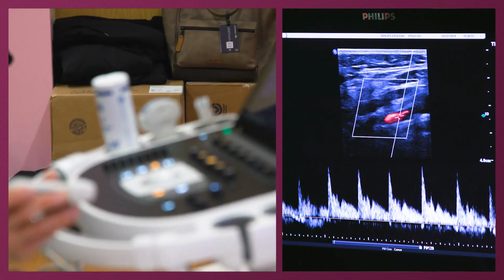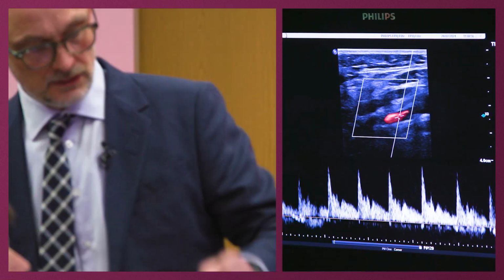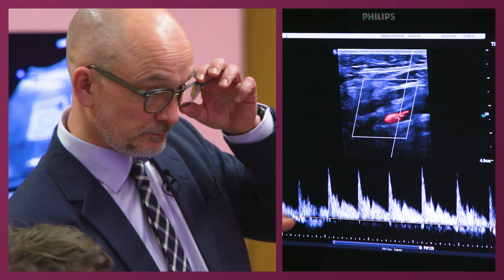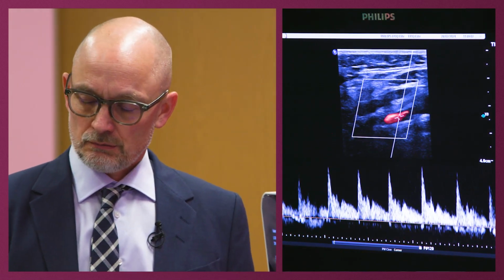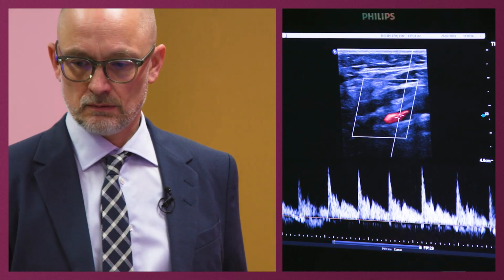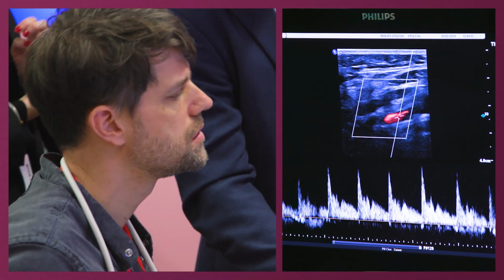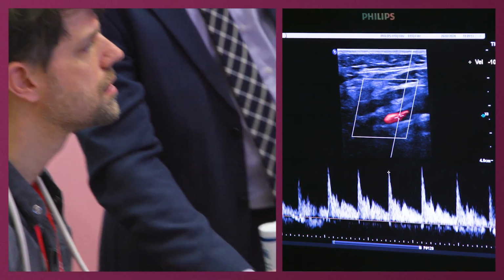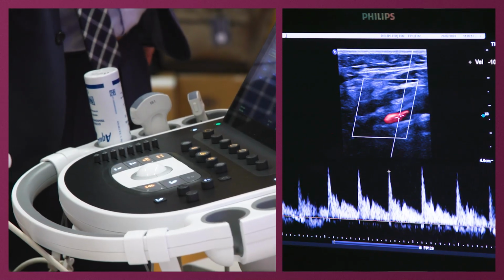Exactly. And that's it. You should mark an image where you have this tapping. If you are... The measurements are done automatically? Or? I never do recordings in the external. No, I don't, but in general you rely on what it shows. Then I would go and measure, but I will do that where I need it. Okay. But it's not very relevant here.